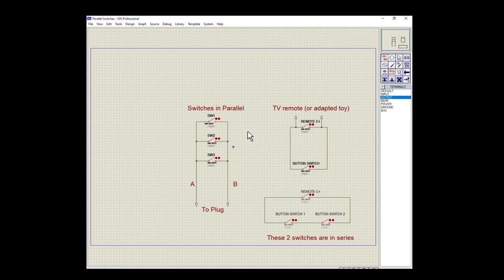Of course, sometimes you hear parallel and sometimes you hear in series. These two switches here are in series. They're in line with each other. The reason we did this is that we wanted this individual to use his left arm and his right arm. If we just gave him one switch, he could activate that one-handed. We want to encourage bilateral use, for him to use both hands. So we're adding switch one and switch two. To activate the remote to raise his channel up, he has to push one switch and the other switch at the same time to complete the circuit to make it work. That's what series is.